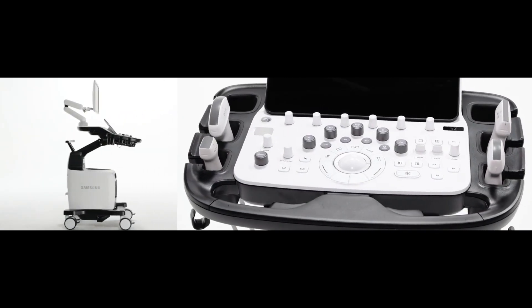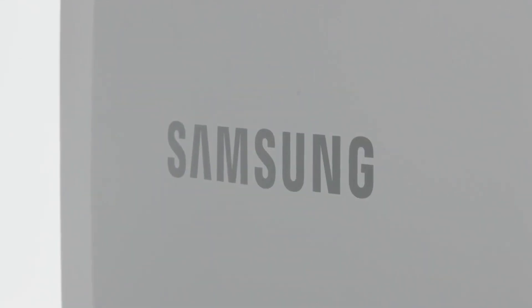With the Samsung V7, it will boost your confidence in obstetric imaging with remarkable image quality and advanced technology.